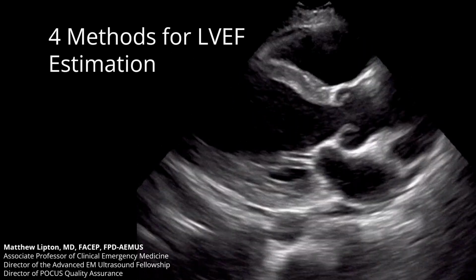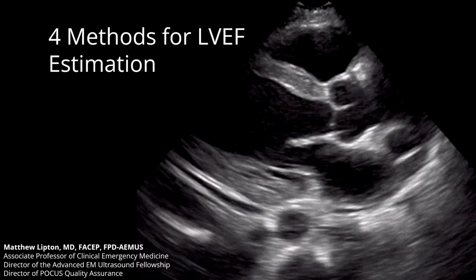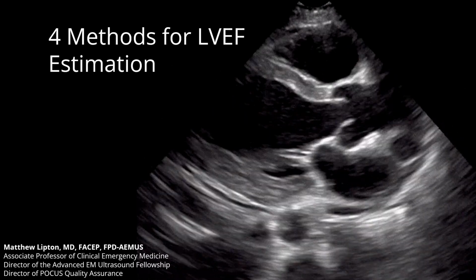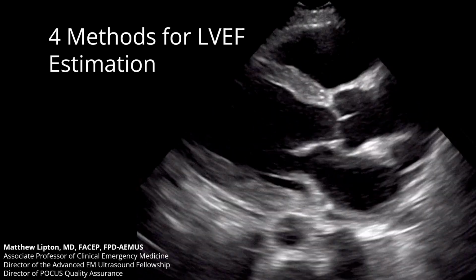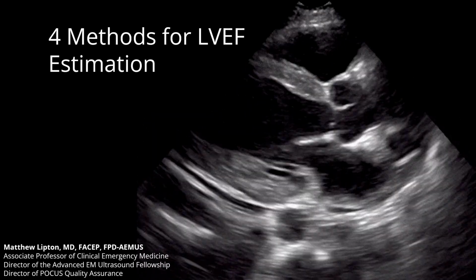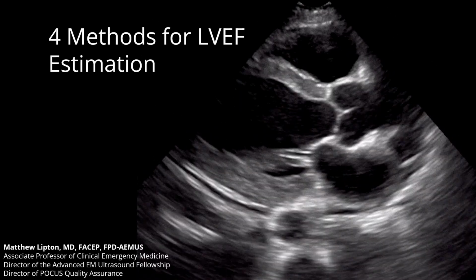When you have an undifferentiated critically ill patient, after initial stabilization, one of the most important pieces of information will be to determine their left ventricular ejection fraction. This helps guide their management in numerous ways, such as fluid administration, vasopressor choice, or initiation of mechanical circulatory support devices. Measuring the left ventricular ejection fraction will be of critical importance and is the topic of this lecture.